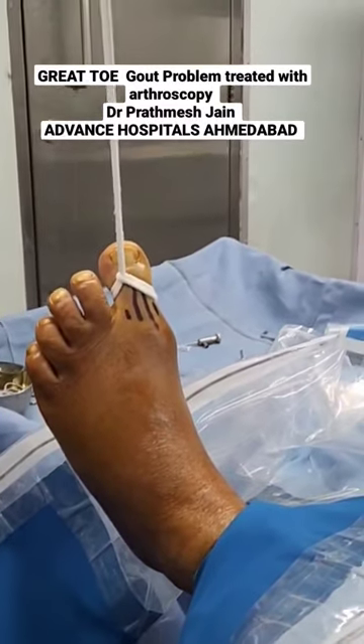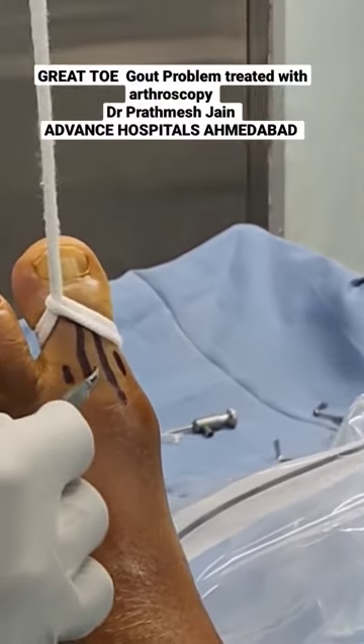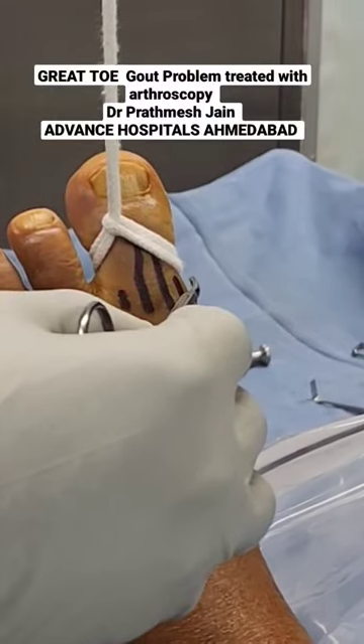Friends, this is the setup of our first MTP arthroscopy. You can see that we have marked the extensor tendon here. The main two portals that we will be working with will be the dorsomedial and the dorsolateral portals.